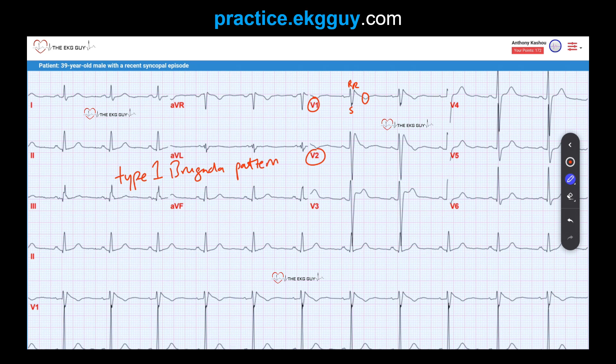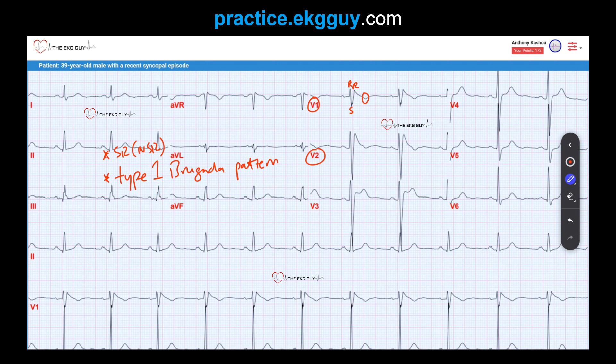This pattern alone is diagnostic for Brugada syndrome. If you had a type 2 pattern — the other type; there used to be three types, now classified down to two — type 2 requires a little more clinical context to fulfill the syndrome diagnosis. Type 1 you want to make sure you diagnose, as well as the sinus rhythm, which was a normal sinus rhythm. Those are the two main diagnoses from this ECG that you don't want to miss.